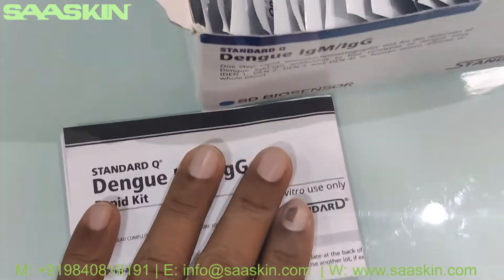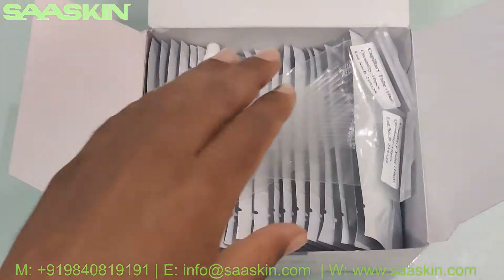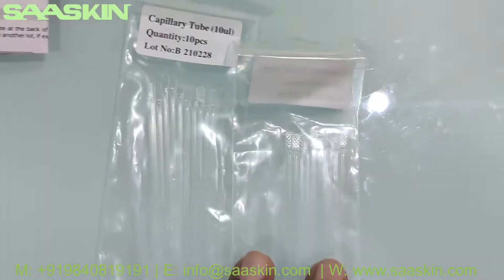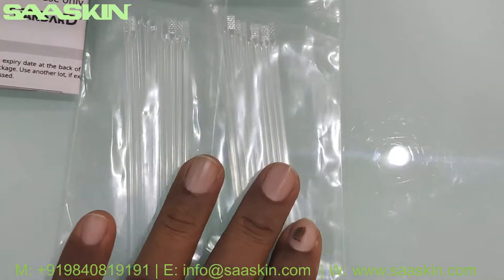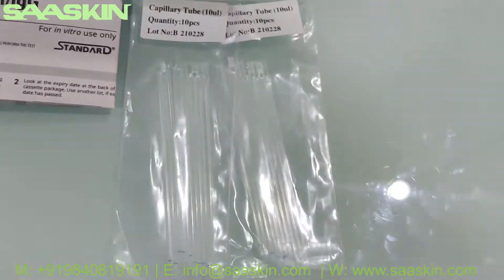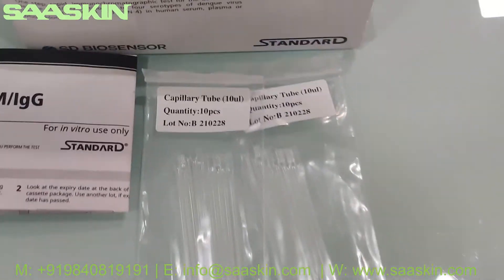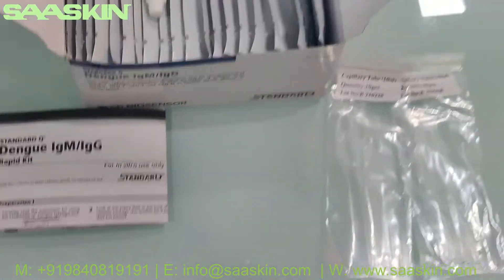Inside the box you have the specimen transfer device — a 10 µl capillary tube. They come in two packs, each pack containing 10 units, giving you 20 specimen transfer devices in total.